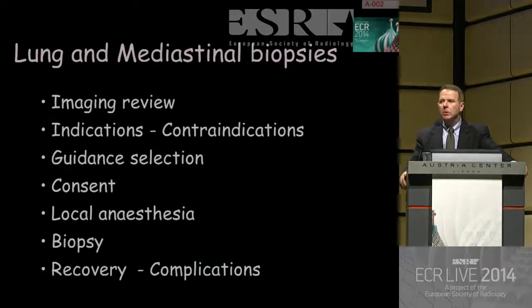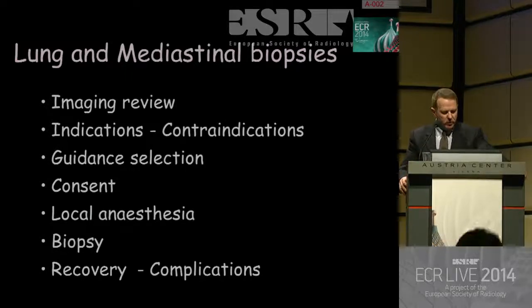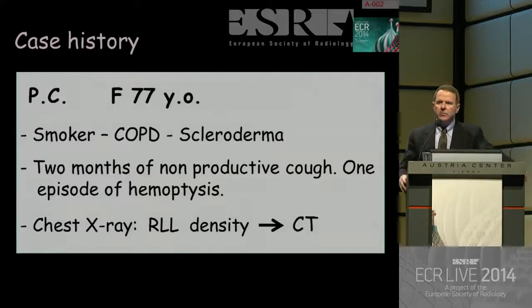When we talk about lung and mediastinal biopsy, there is a list of items that we have to consider, and these items will be the topics of my lecture. We will talk about reviewing of the imaging, indication and contraindication, the selection of the type of guidance that we prefer, how to obtain consent, local anesthesia, the biopsy itself and auxiliary techniques, and how to manage complication and the recovery period. So let's look, for example, at this patient.